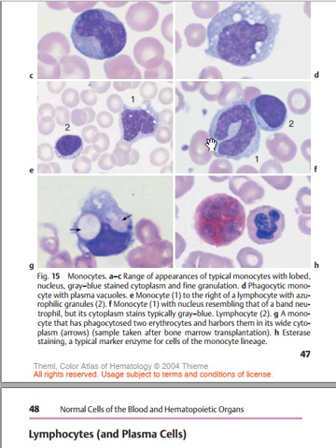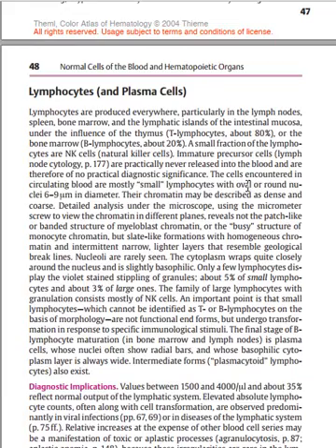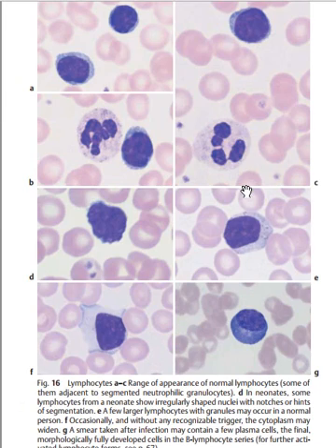Still monocytes here in diagram F, you see monocytes with a nucleus resembling that of a band nucleus. You see the band nucleus that you have seen at the level of the precursors of the neutrophils, which had a U shape, an over-curved U shape. This is also a monocyte, resembling that band nucleus. In diagram G now, you have a monocyte that has phagocytosed, with vacuoles inside, and this is diagram H with esterase staining. So the staining method that has been used here is esterase, not the same one that we know. Now the next one is lymphocytes.